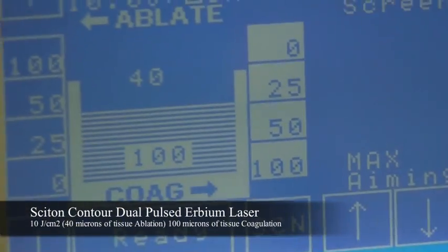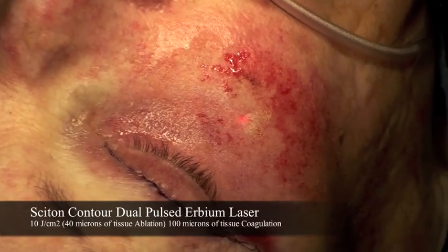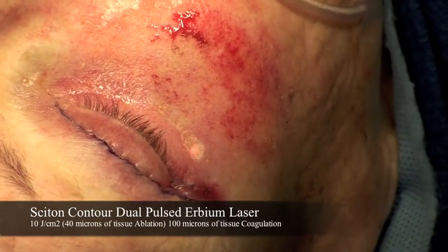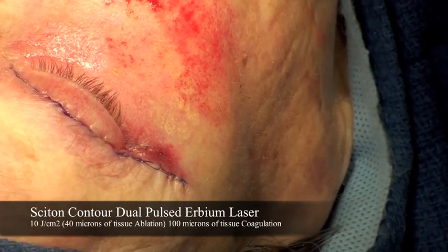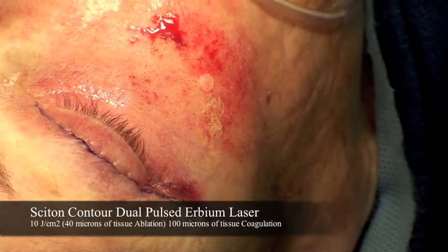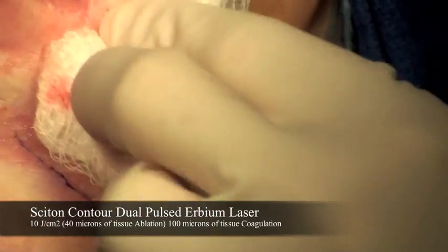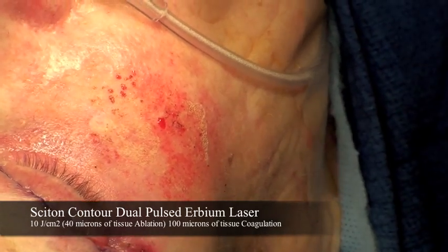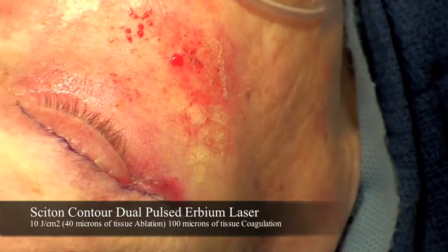With this third application of the laser, we change the settings to 10 joules per centimeter squared with 100 microns of subablative energy deposition known as coagulation. Here we have an interaction of the laser with the chromophore, which is water in the tissue, which creates thermal injury, which causes collagen fiber shrinkage. The end point of this procedure is when we see no more tissue tightening as a result of this sub-ablative energy that we're applying, and we're going to be seeing that here shortly.